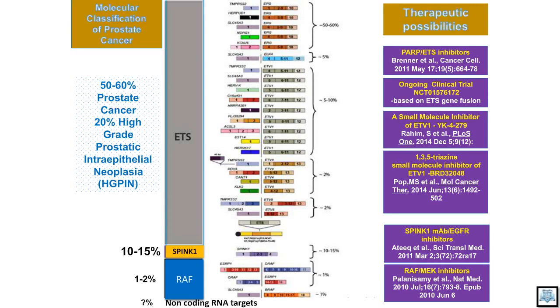So given the identification of several molecular markers in prostate cancer, identifying distinct molecular subsets, and with the development of therapeutic inhibitors targeting these molecules, I think it is very important that we have a method that is much more reliable and very robust for the detection of these molecular markers in a given tissue, whether it is a biopsy tissue from metastatic prostate cancer, or from the initial diagnostic biopsy, or from radical prostatectomy specimens. We should be able to classify these patients based on these molecular markers.